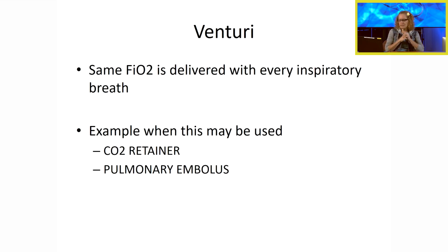Okay, so the same FiO2 is delivered in every inspiratory breath. So this may be used in the case of a CO2 retainer or for a pulmonary embolus. So what do I mean by a CO2 retainer? What does that even mean?